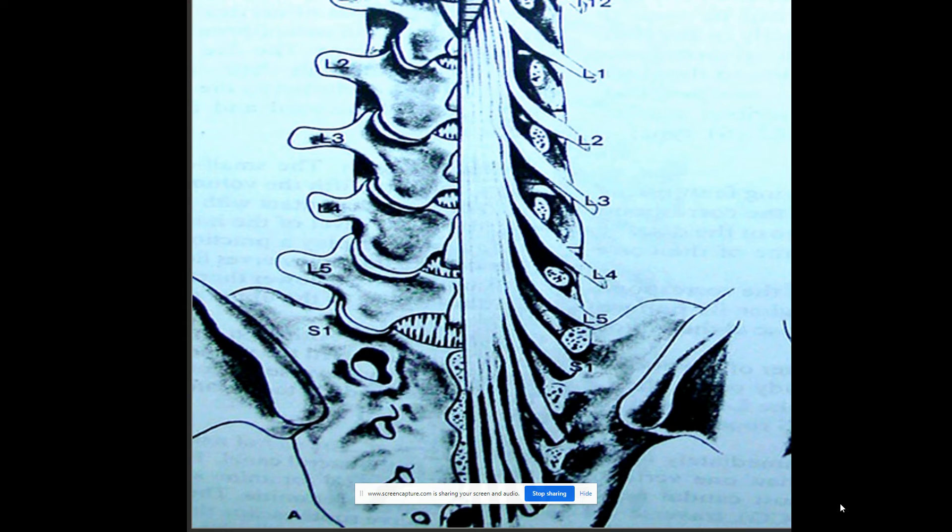First with a burr and then finishing it with a Kerrison punch. Basically, if you can find the S1 nerve root and then track it rostral and look lateral, you should be able to find the L5 nerve root.